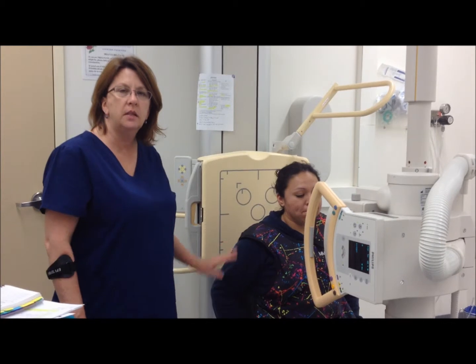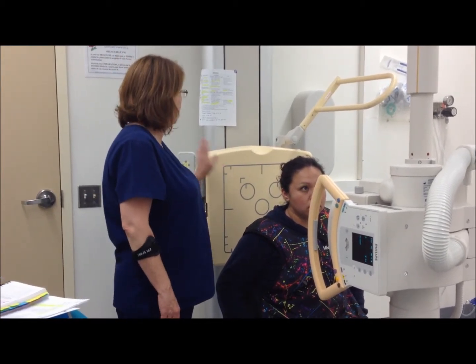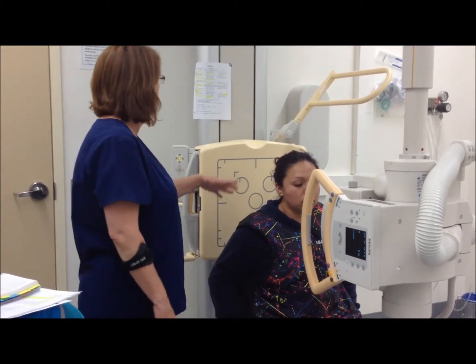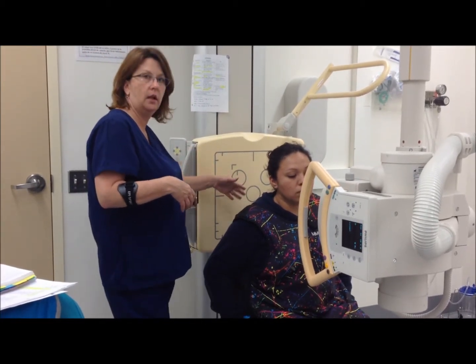Okay, for our next exam, we're going to be doing an SMV. We have an 8x10 cassette in the machine. Patient is seated in front of it, she's shielded properly. We're going to have her lean back, the top of her head against the IR.